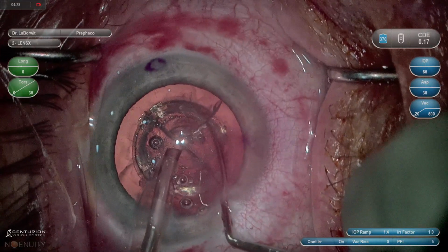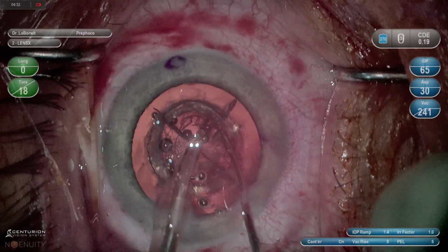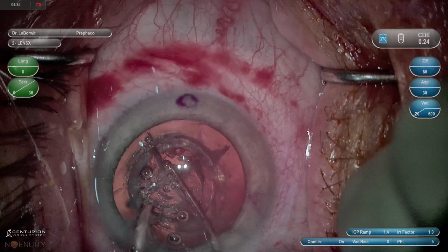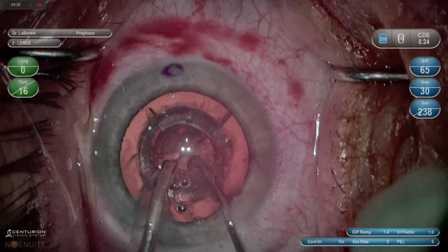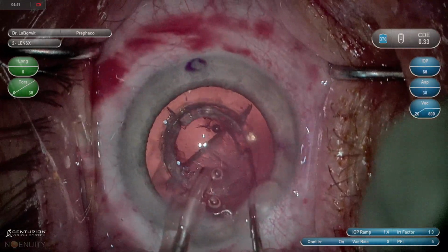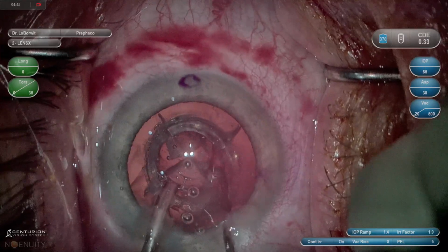And sometimes I'll even crack a little earlier to help get my piece in to lift it up. I have a lot of confidence as I go under these pieces because I know the horizontal cut's at 60%. So again, there's a measuring stick having that laser cut, and it'll guide me with my second instrument.